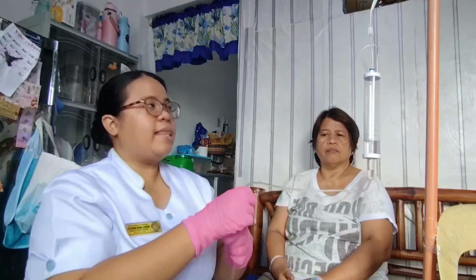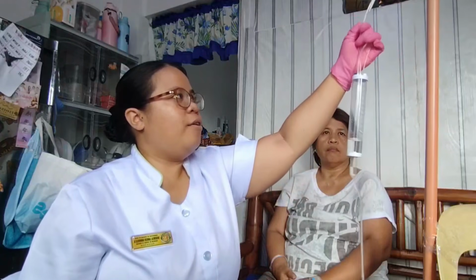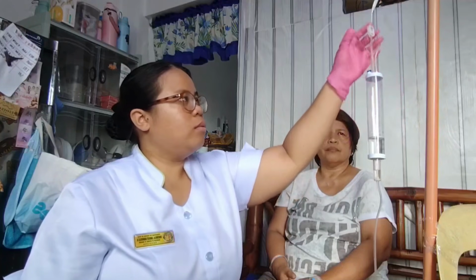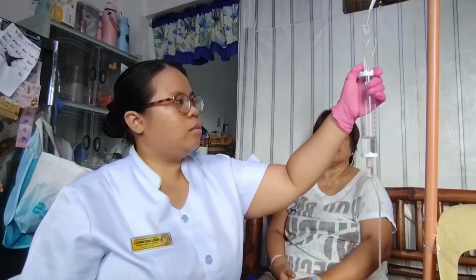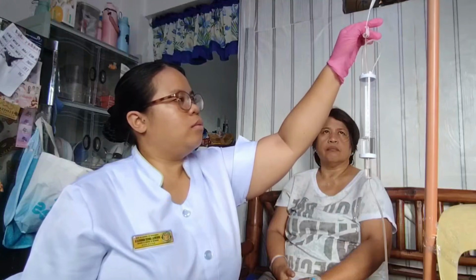Okay, so after priming, we're going to close it first, and then we're going to fill again the volumetric chamber with the prescribed diluent. So the doctor ordered 50 ml diluent for the antibiotic. So let's fill this volumetric chamber. Okay, so assuming that we have already filled this up to 50 ml, then we're going to proceed in incorporating our medication.